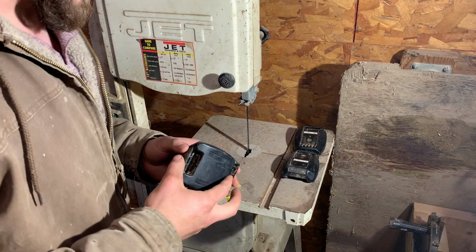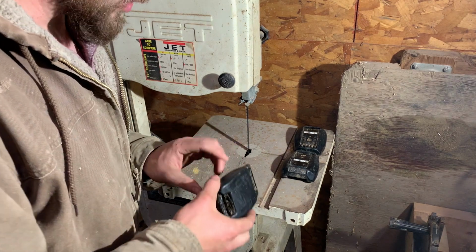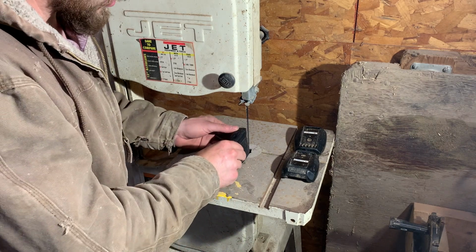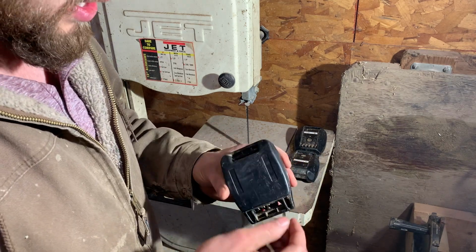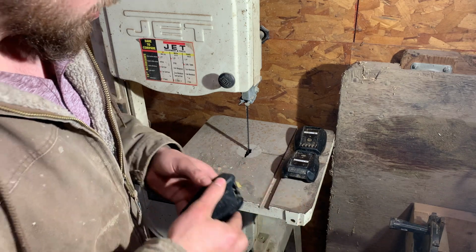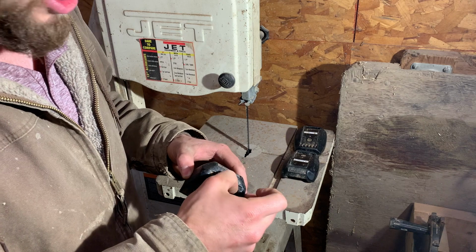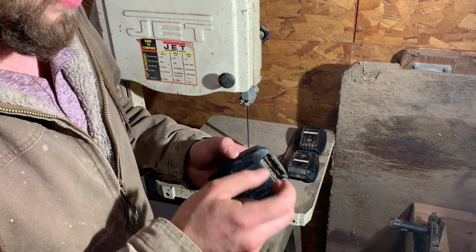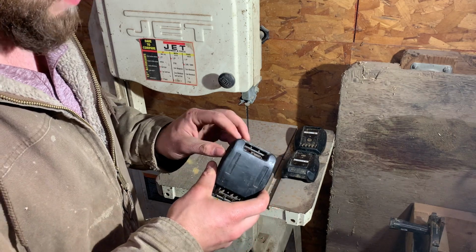Okay, so the first step is I always start on the right side. It's just me, because I have a system that way. I start here and cut on this side, then I cut on the top, this side, and then the bottom. A couple of things to note: on the top here, when you cut in, you just go directly all the way through. There's nothing that you'll cut here, at least on the newer ones. Some of the real old ones have some things that you might hit, but these newer ones, you don't have to worry about that.